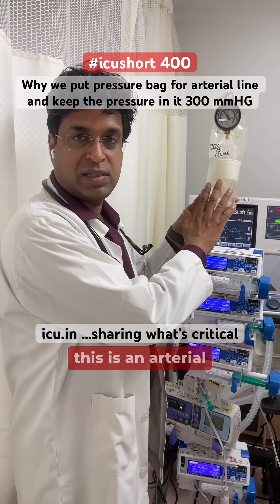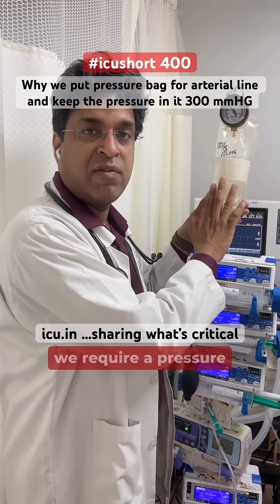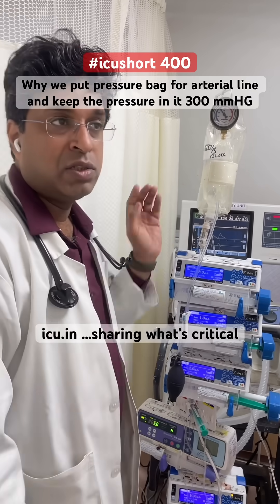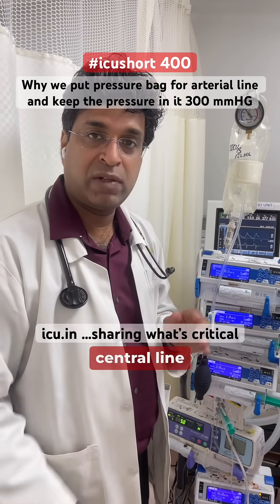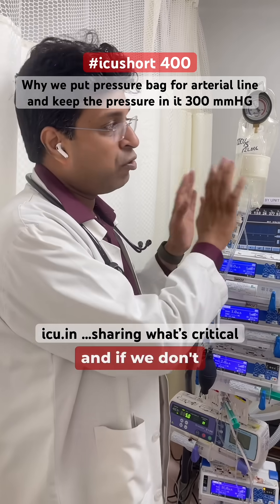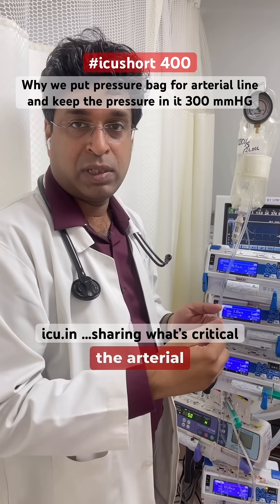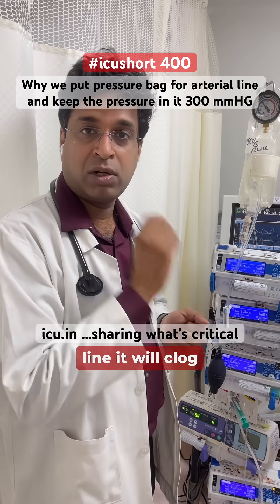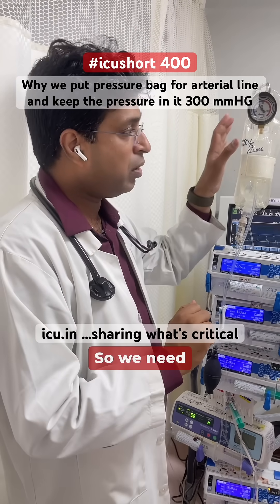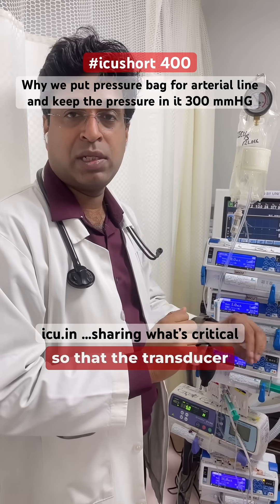You can see this is an arterial line pressure bag. Have you ever wondered why we require a pressure bag when we put an arterial line in place? Unlike a central line where the flow is towards the patient, in an arterial line the flow is away from the patient. If we don't provide counter pressure, the arterial blood pressure will cause flow back into the line, clog the transducer, and block it. So we need counter pressure to keep the line flushing and prevent backflow.